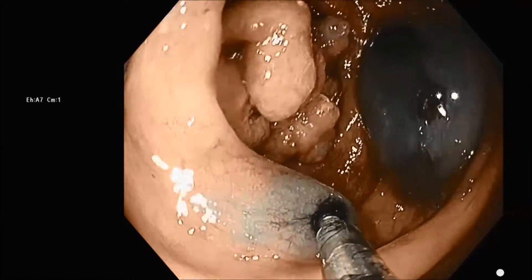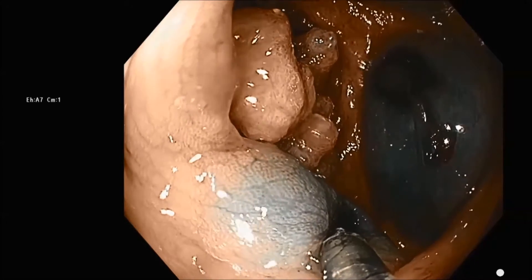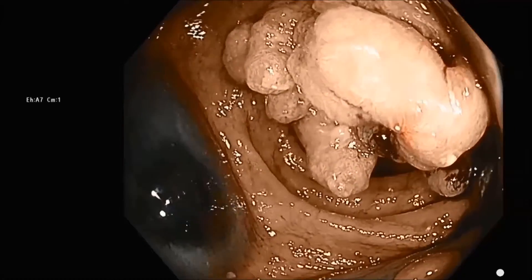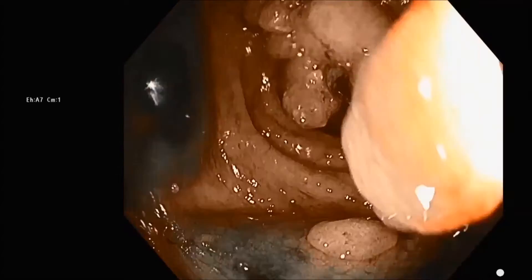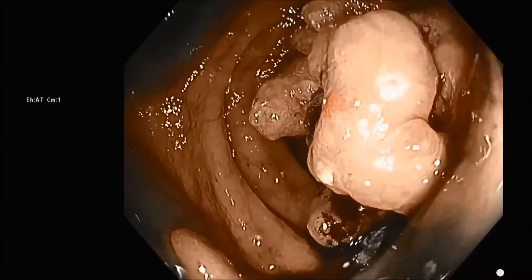This is the bleb technique. The blebs are usually made with saline, which is clear and doesn't have this colored appearance, but if you have some fluid left over from an EMR, you certainly can use that to create your blebs.